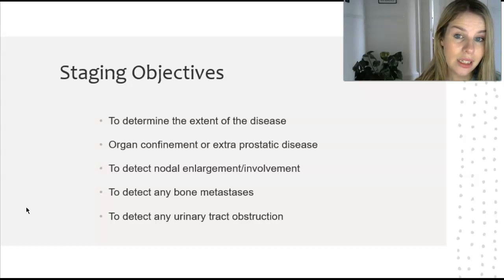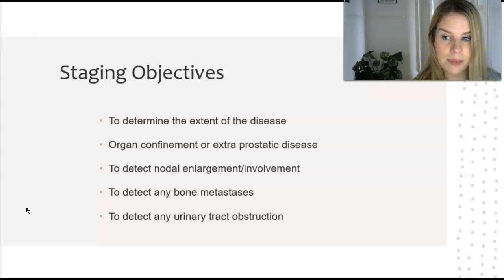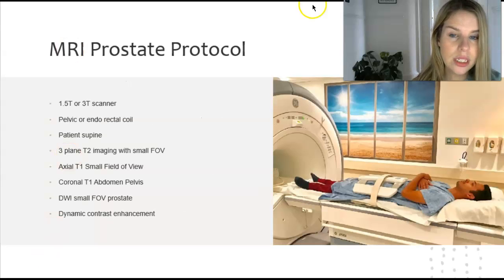And also an important thing to look at is whether or not there's any urinary tract obstruction as well, because that means that the tumour has gone out of the confines of the prostate. So there is a particular protocol that is used.